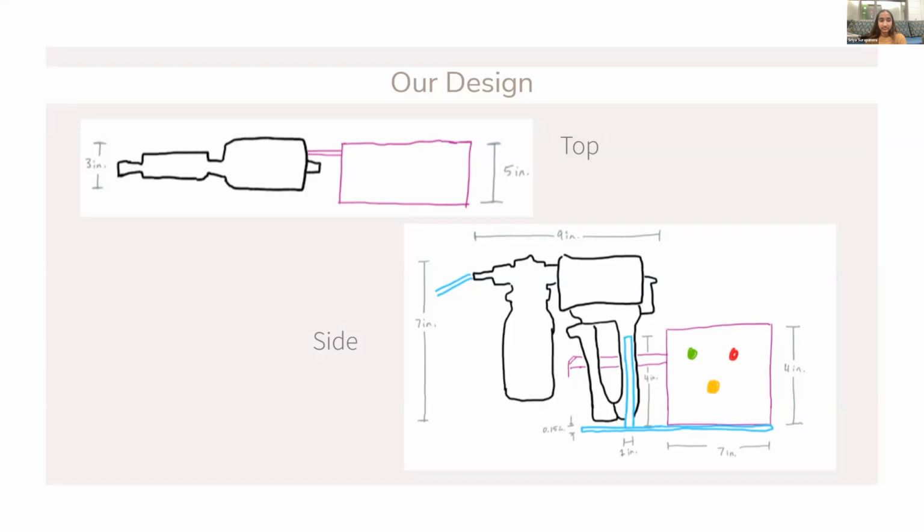To automate the pump, we then created a control unit using a hooked metal bar, gear, and motor system controlled by 3 buttons. The hooked metal bar is moved with the gears to press the handle of the pump. For the device to be used, the mom should first press the green button. Then for the next 2 hours, the mom should press the yellow button every time that the suction bottle handle needs to be pressed so that the fluids can be removed. After the 2 hours pass, she should press the red button. From there, the control unit will remove fluids at the same time intervals the mom did during the 2 hours until she needs to change the time intervals of the suctioning.